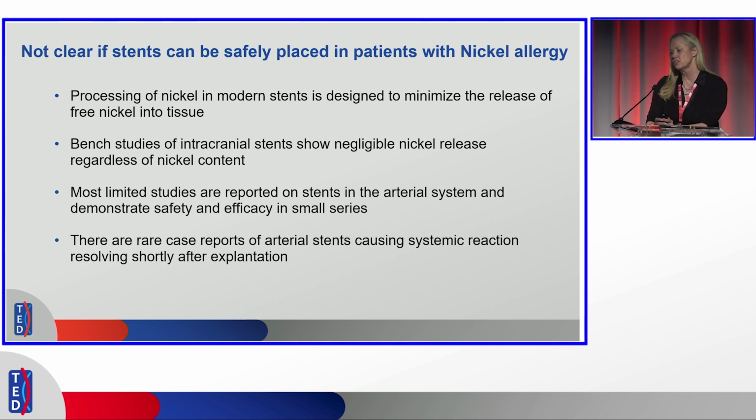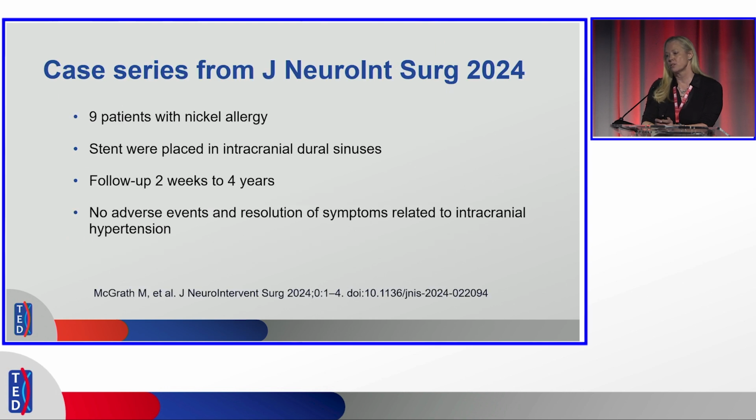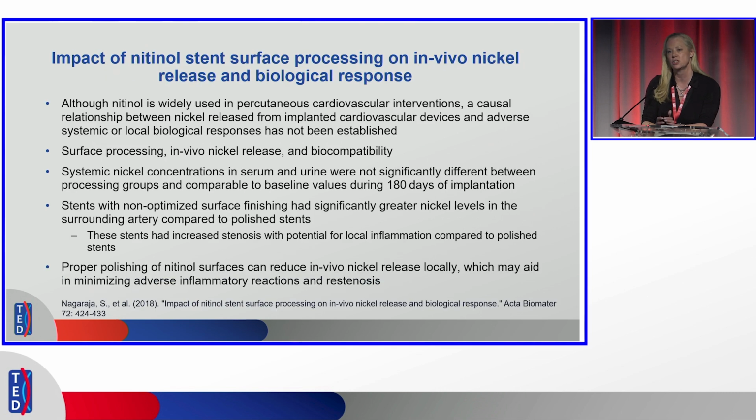But the bench studies that we have are pretty limited, and most of the explanted stents that are in the literature were arterial stents, one in the right iliac and one in the left lower extremity, where they had true redness, swelling, rashes immediately afterwards. Nothing was helping. They got explanted, and it all reversed. There was recently a case study of 9 patients with nickel allergy. They were stented in the intracranial dural sinuses for intracranial hypertension symptoms. Follow-up was 2 weeks to 4 years, and these were all nickel allergic patients. They had no adverse events, and resolution of symptoms related to intracranial hypertension was achieved in all of these patients.